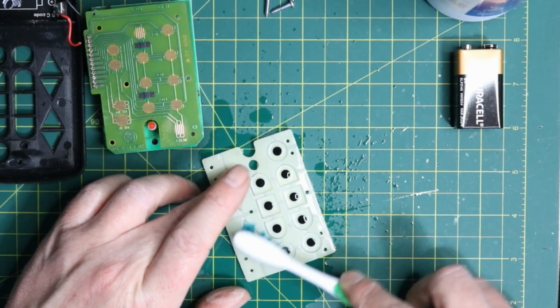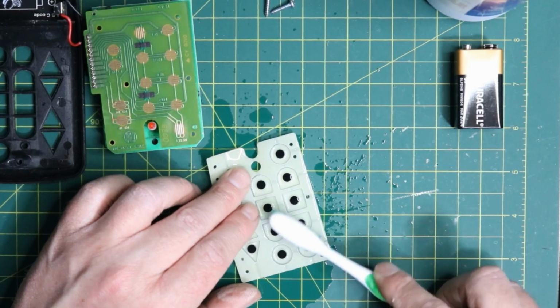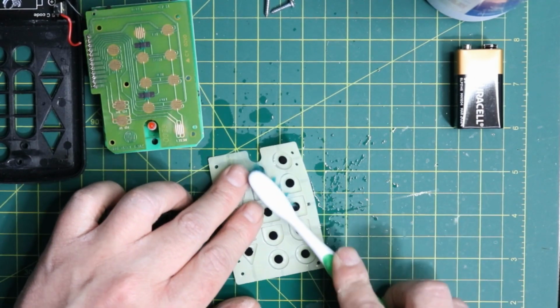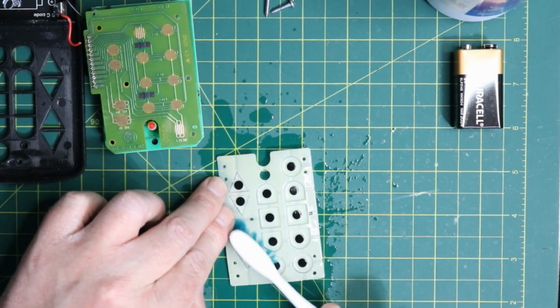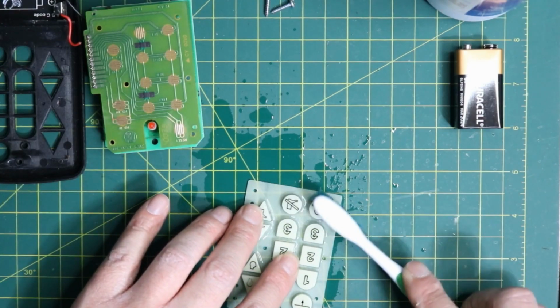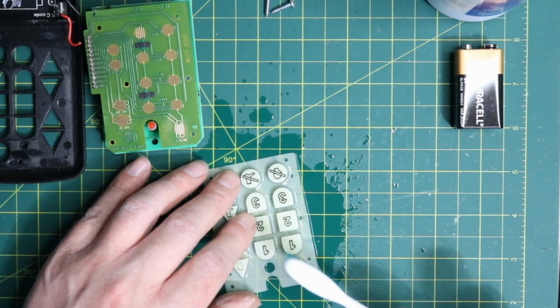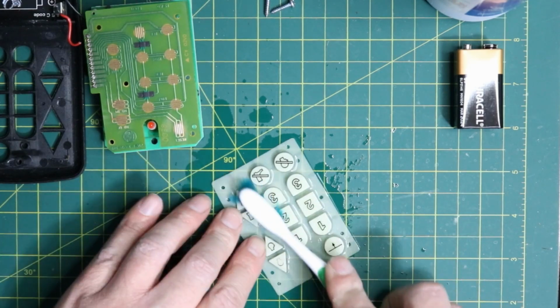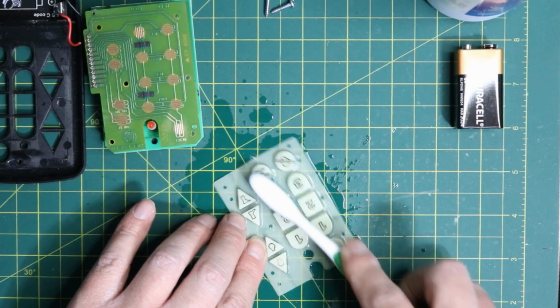So these black pads here, if anyone knows any way of replacing them or adding another layer to them, let me know down in the comments section there, and let me know if there's a way to repair these or what the best route to go on these are. So I'm just going to get all that grit from fingers and all that out of there. Once again, it's not bad because I've already done it before, but we're just going to go over it all again in hopes that we can make this last a little bit longer for them.